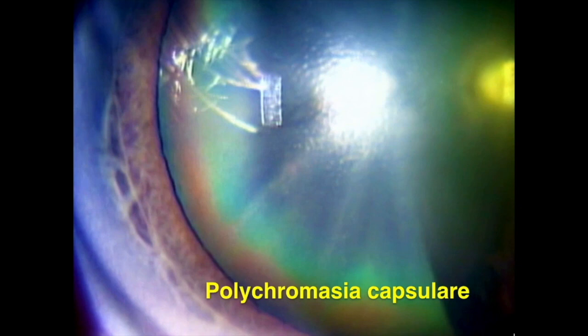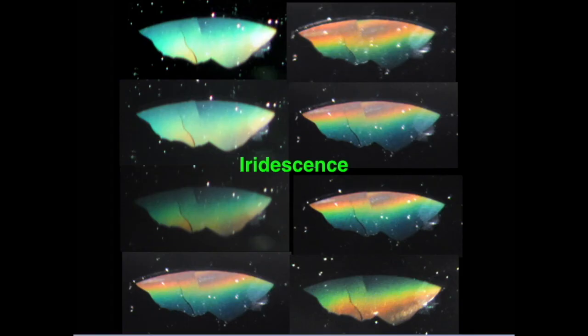This is sort of a medical curiosity. This is Polychromasia capsularia. There's a family in the Ohio area that actually has iridescent lens capsules. This is one of the few examples, I think, of true iridescence of human tissue. Here's a segment of the lens capsule after surgery, and this montage shows a fragment of lens capsule from an affected patient.